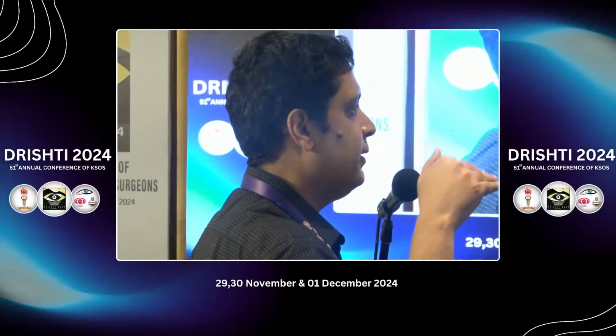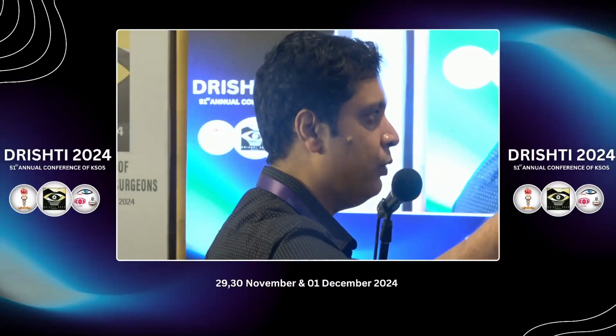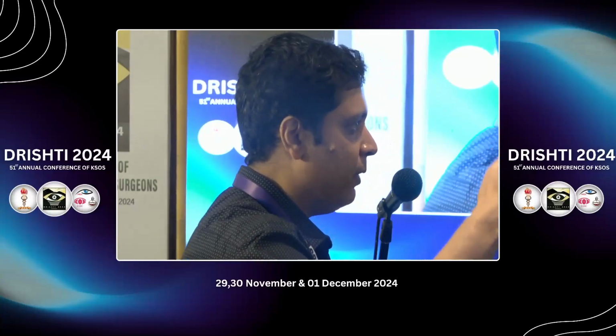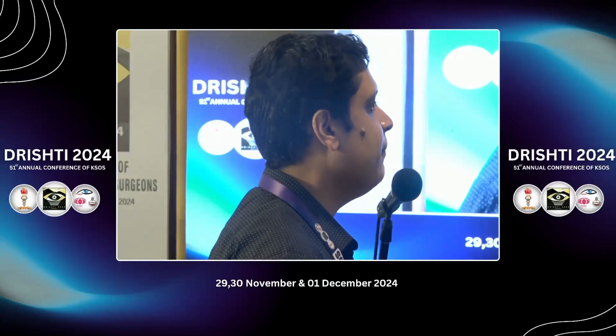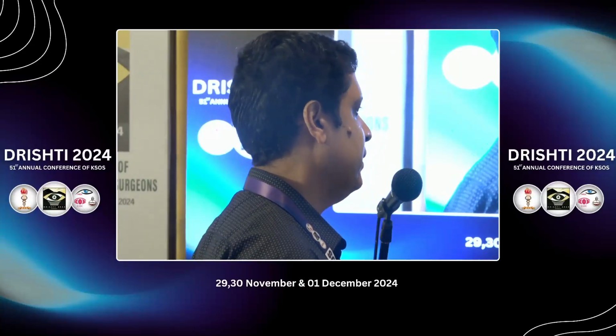So let's say somebody has an advanced glaucoma, everything appears red on OCT, so you cannot use OCT anymore to follow up that patient, whereas OCTA can probably be used to further document loss of vessel density, though we would still probably use a 10-2 or macular fields to be more precise in such follow-ups. But in difficult patients, this could be a potential advantage.